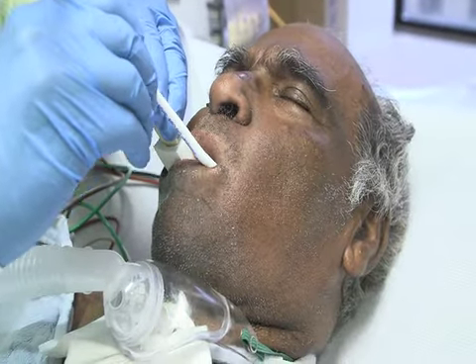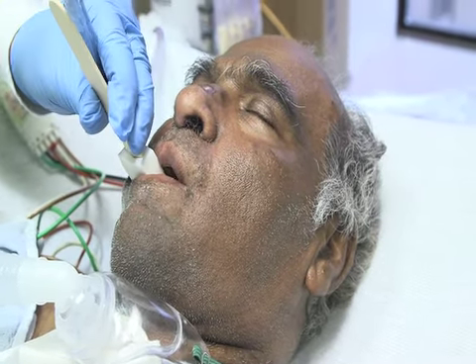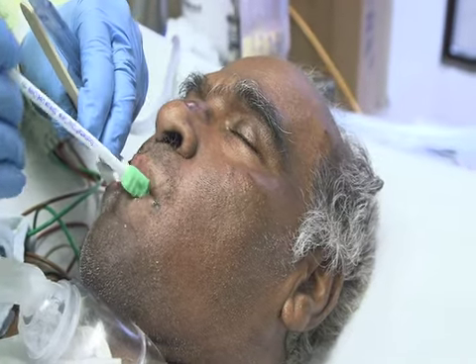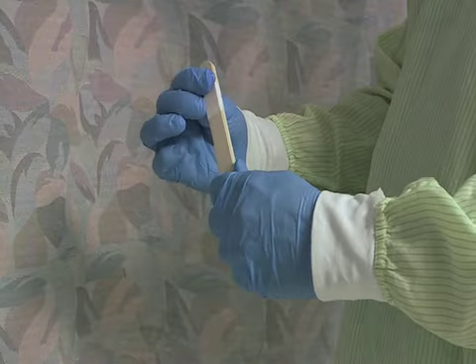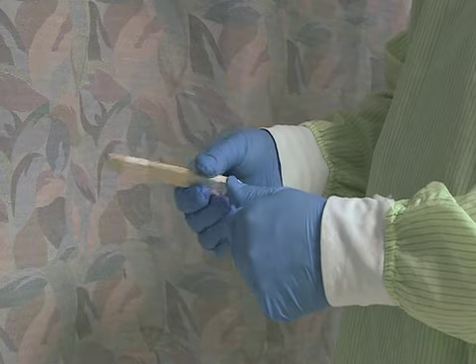If your patient is biting, agitated, uncooperative, or having difficulty opening their mouth, consider using a disposable mouth prop designed for this purpose. A single-use mouth prop may be fashioned by wrapping several tongue depressors together using gauze and tape.